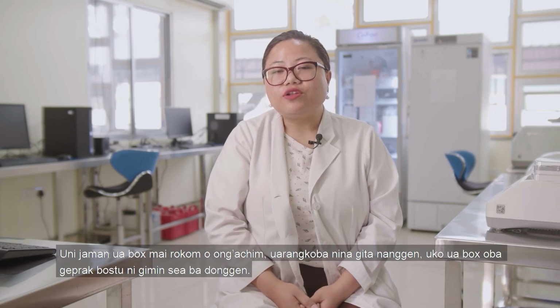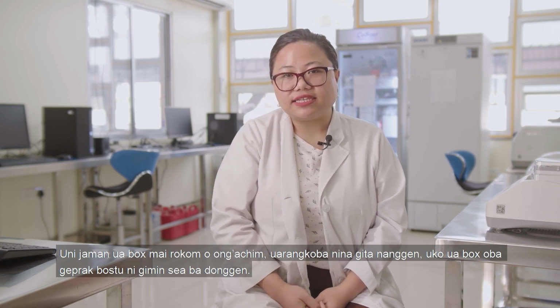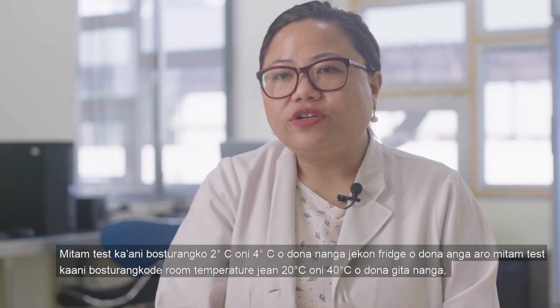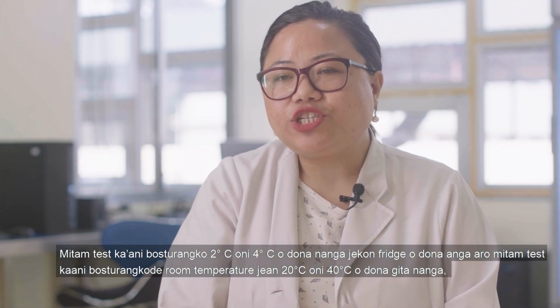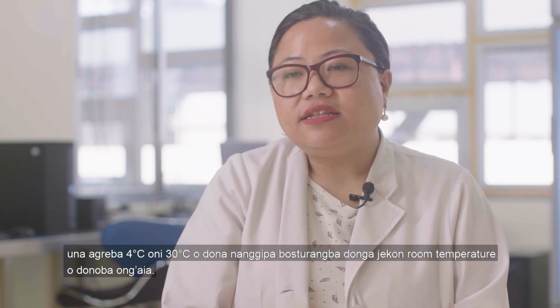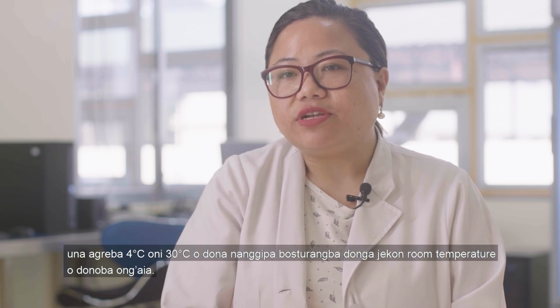The next step, you look at the storage conditions of your test kit. In the box itself, it will be mentioned the storage condition for particular kits. There are certain kits that you can keep in 2 to 4 degrees Celsius, that is in the refrigerator, and there are other kits that you can keep at room temperature, that is 20 to 40 degrees Celsius. But there are certain kits wherein the temperature lies between 4 degrees Celsius to 30 degrees Celsius. So we advise that you keep it in room temperature.